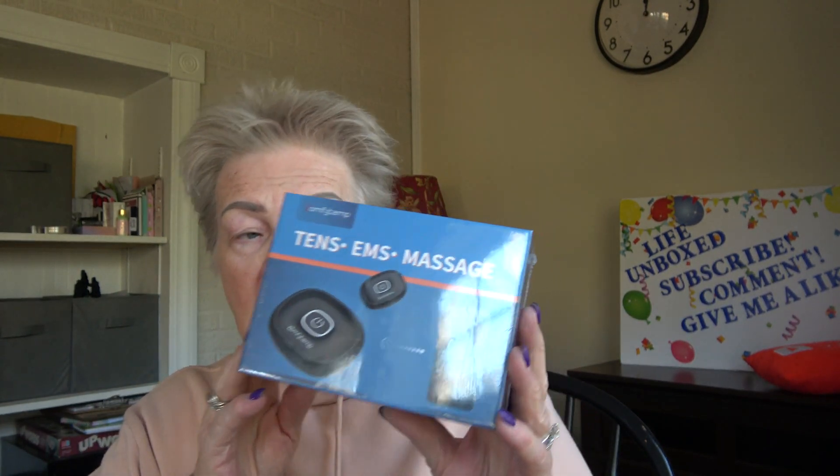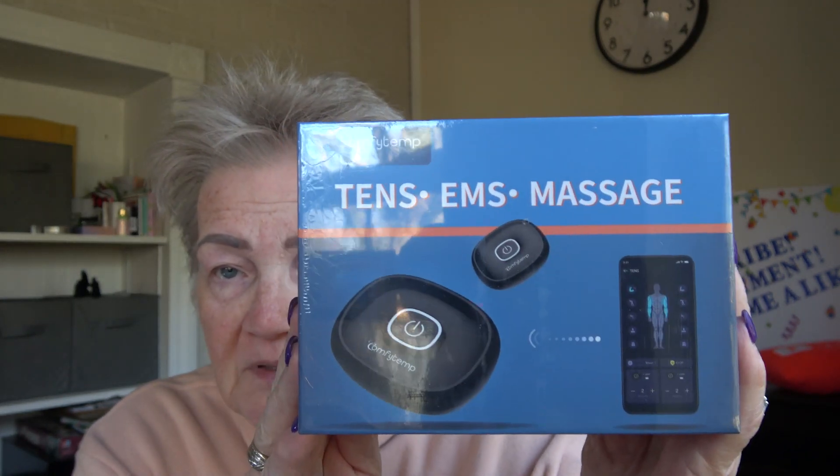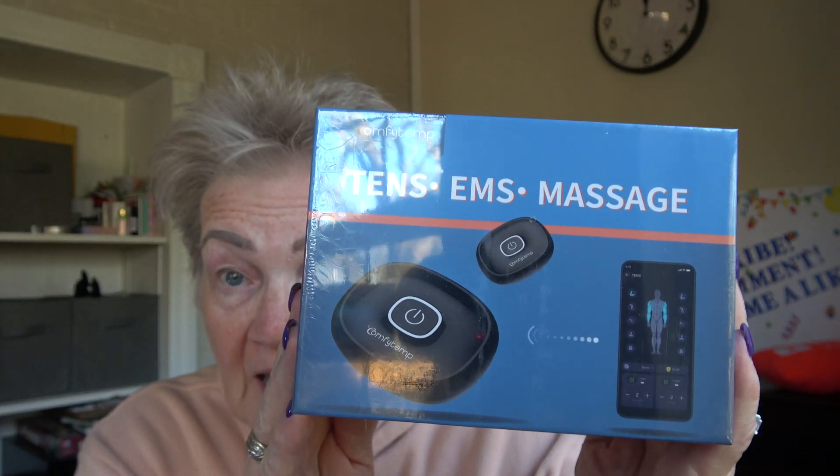Hey everybody, it's Marion from Life Unbox. It's been a while since I did a video, but I'm going to do a video on this TENS unit today. This is a different one that I got before. I don't think you have to plug anything in — I haven't opened it up yet — but this is what it looks like, and I'll be doing a review on this today.